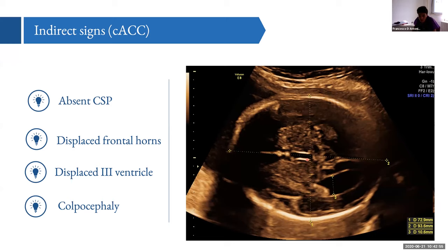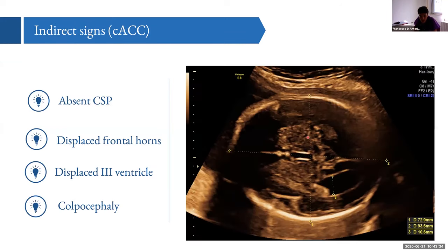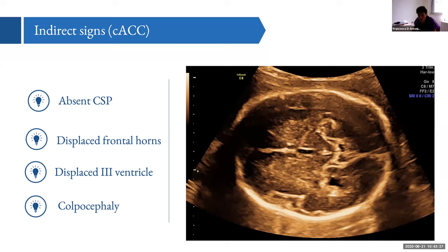A third sign is widening of the interhemispheric fissure and upward displacement of the third ventricle. Comparing a normal fetus — where you can see the corpus callosum, the cavum septum pellucidum, and the frontal horns in close relation — in ACC there is no cavum septum pellucidum at all. Furthermore, bundles of aberrant fibers run parallel to the midline, causing lateral displacement of the frontal horns, which are pushed outward.